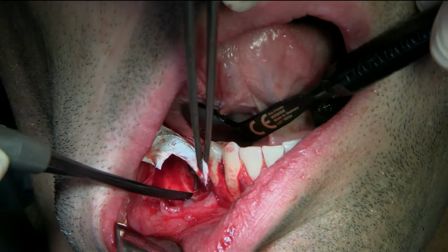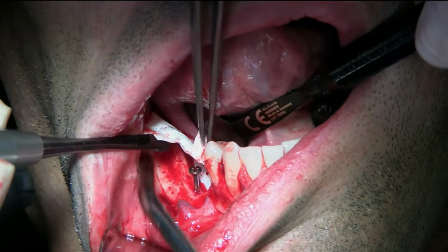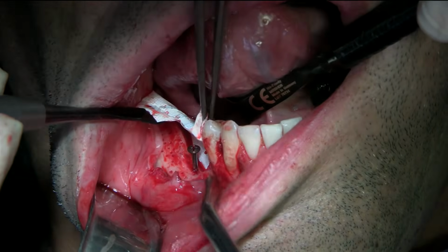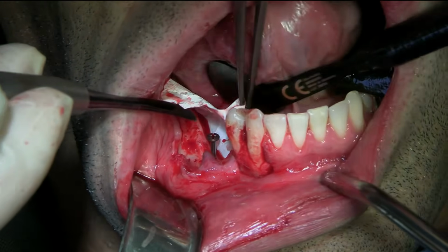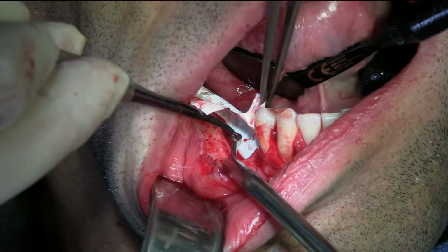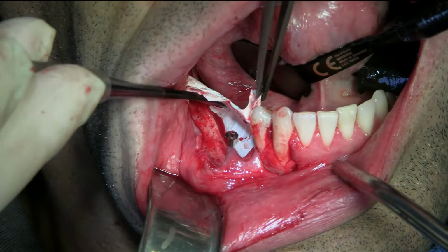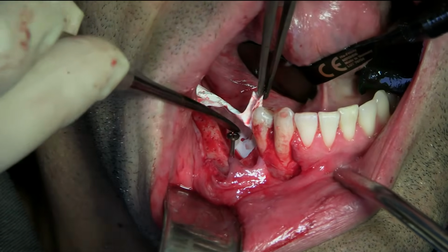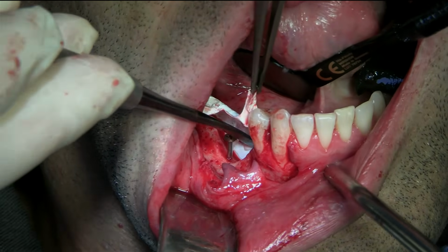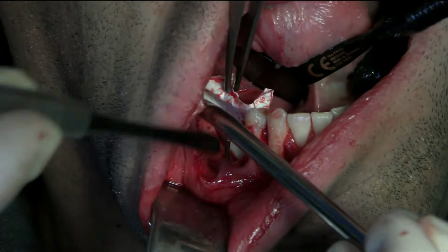So here's the membrane, here's the defect. You can see the membrane on the lingual. A little bit to the left. Perfect. So you can see how I built a wall with the membrane, and that's kind of your new bone wall. It's fixed on the anterior with the screw, and it's stable, and it's fixed on the distal with the pin. So now we can start dropping the bone in.